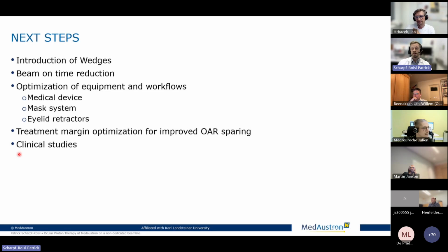We actually retake the reference image every time we change anything on the LED position. As soon as we change the LED position, we take a new reference image, because the reproducibility to the CT is quite nice, but we also have different light conditions and so on. So it's very hard to use the old reference images as a new position because with the translation, we also make up for any mispositions within the mask. And this you would see immediately. So the precision should be much higher than what we can see in the reference image from the camera.